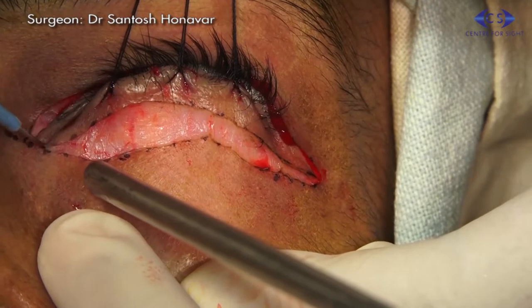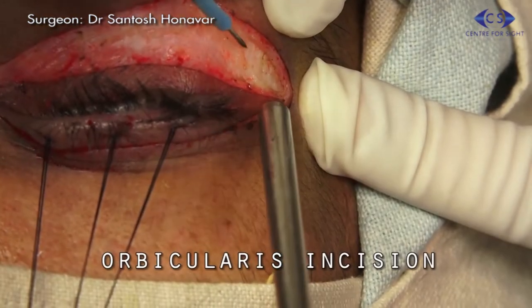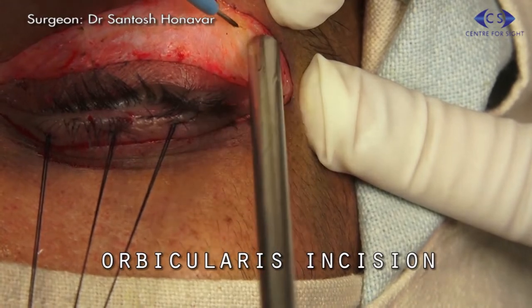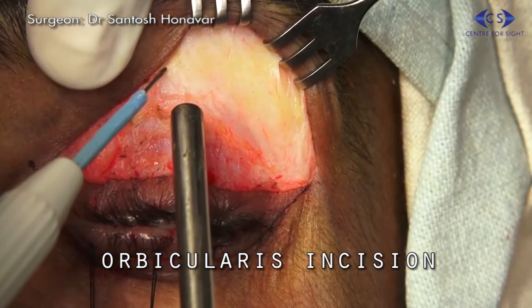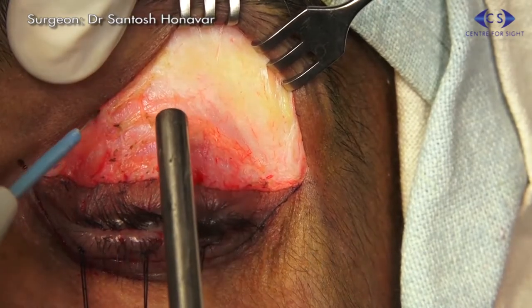Dissection is carried in the preseptal plane, which decreases the likelihood of violating the orbital septum. This is especially important in our case where the tumor is present in the anterior orbit.